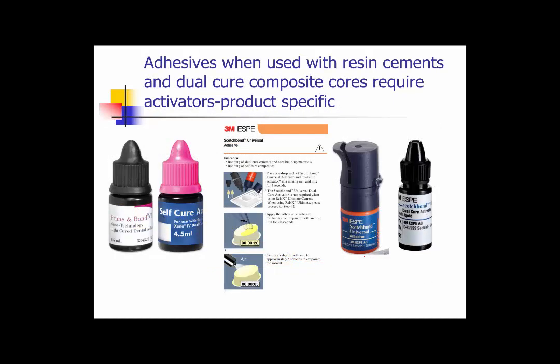And in fact, when adhesives are used with resin cements and dual cure composite cores, as I mentioned earlier, they require activators that are product specific.